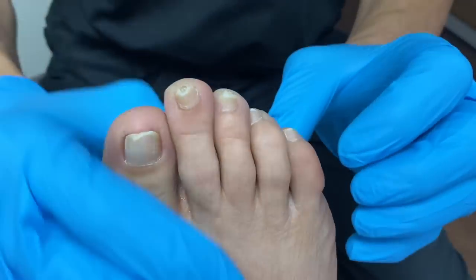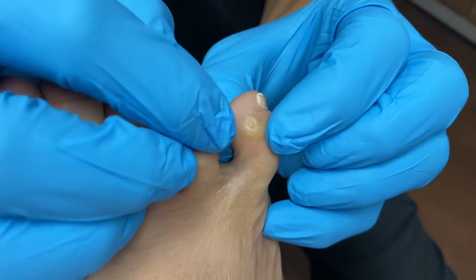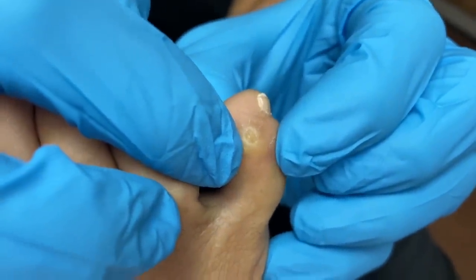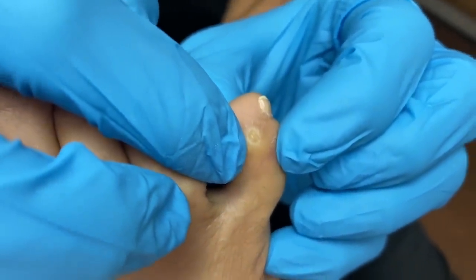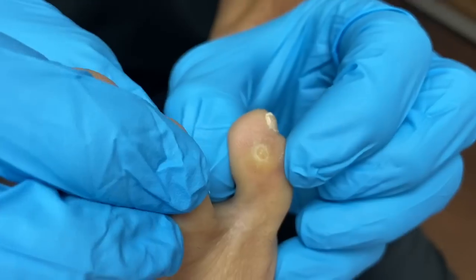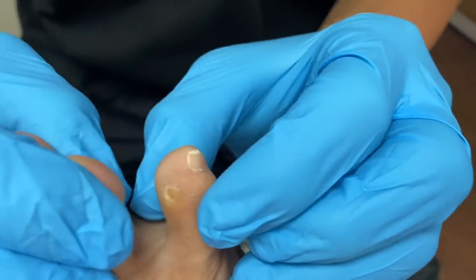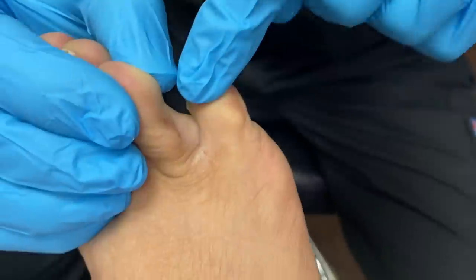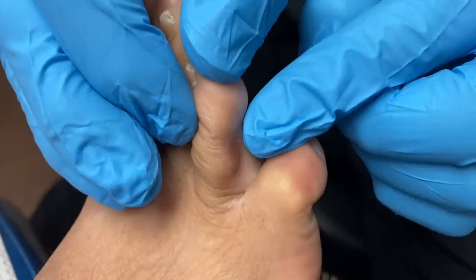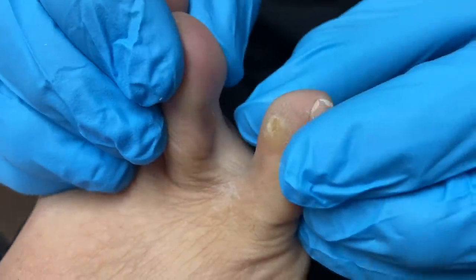Let me show you where. Look at this — ladies and gentlemen, this is an incredibly painful lesion. I want you to see what I mean by kissing. You can see the indentation right here — there's a clear indentation.